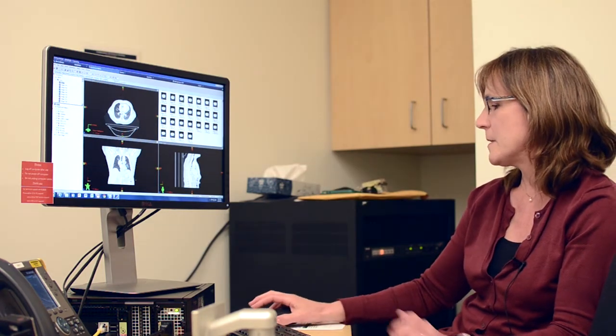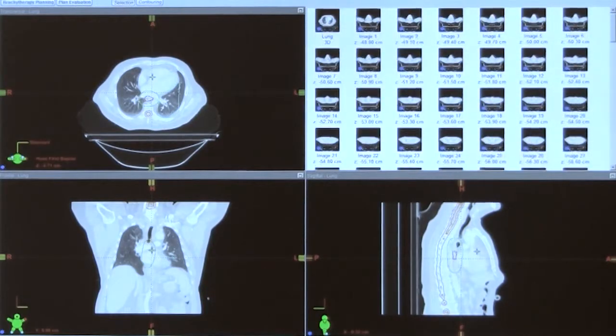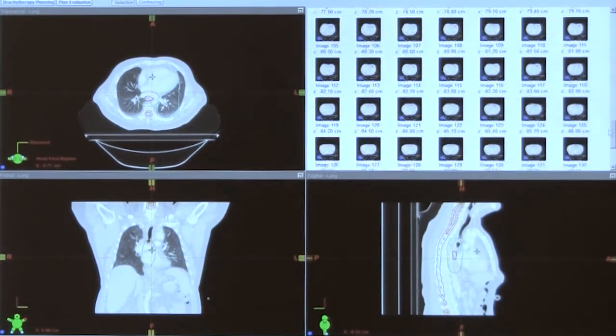This is basically my workstation all day long. Over here you have all the axial slices taken at the time of simulation. The planning system will create a 3D image that we work on and do our planning from. Some of the structures we encounter in our pathway when treating a tumor located in the esophagus would be the spinal cord, the heart, and the lungs — all critical structures. We want to maintain their integrity while treating the tumor volume to enough dose to rid it of the cancer.